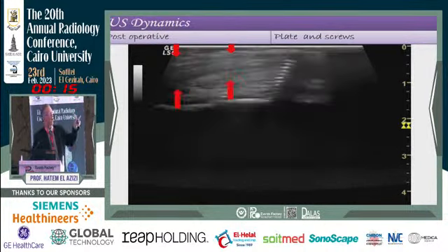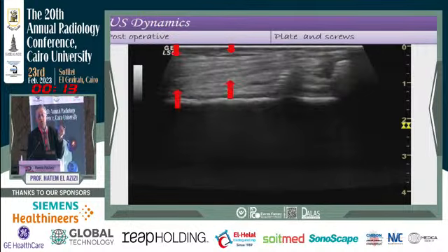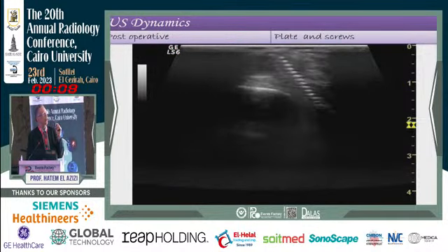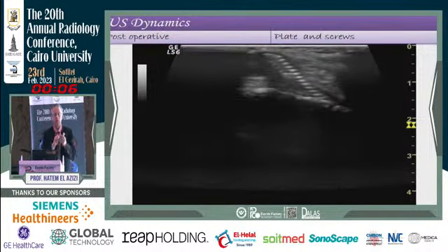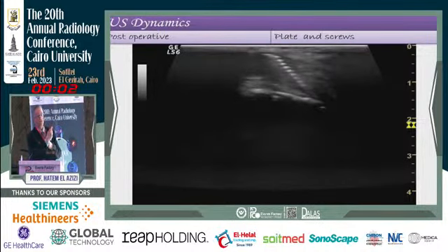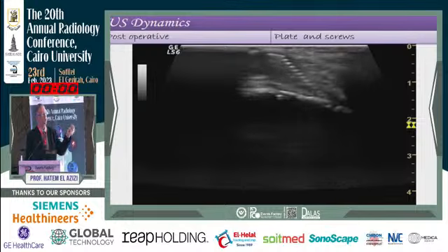Again, we can see a halo sign, a loosened part. This tendon starts to be torn. We cannot move the tendon because the nails are within the tendon, but we can still see a little movement of the screw within it. Again, it needs an operation to remove this.